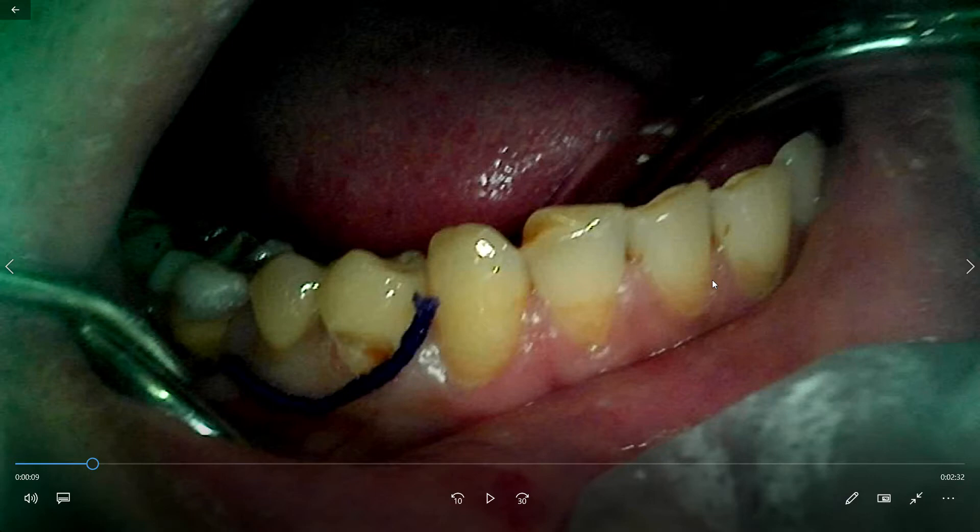There are different types of gingival cords available. According to thickness, there are three types of cords: 00, 000, and 1. Number 1 is mostly the thick one and 00 is the thin one. It depends upon the biotype of the gums — the biotype thickness.